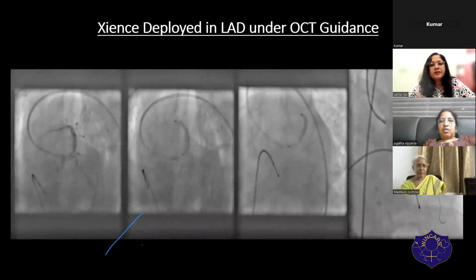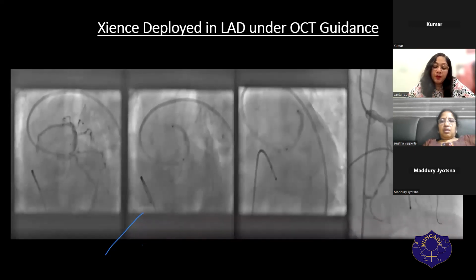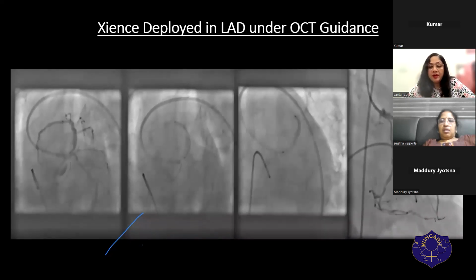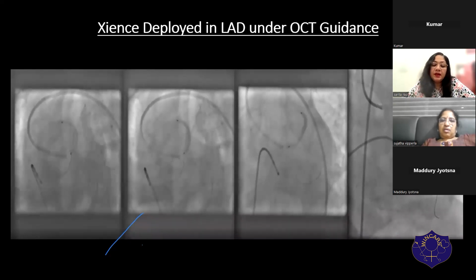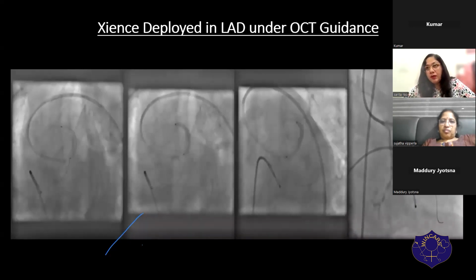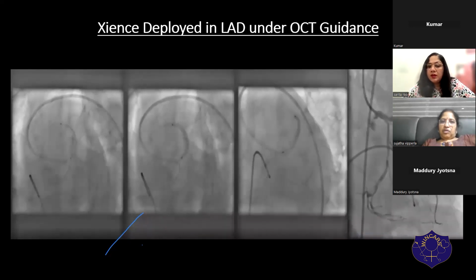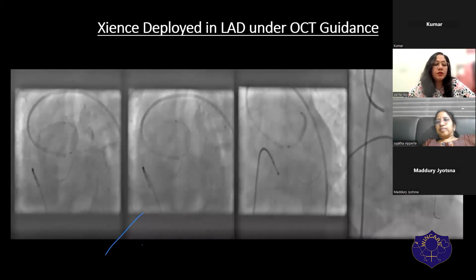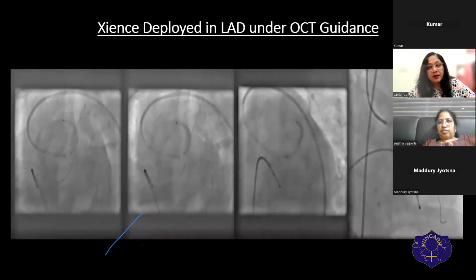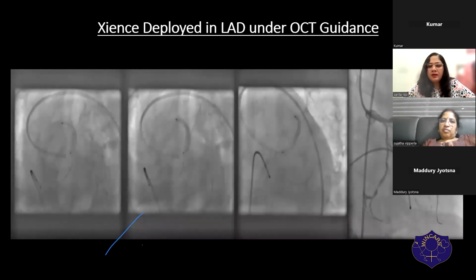Absolutely, madam. That is the most important thing: cutting has to be taken at the proper point in the procedure. When you have already created cracks, when you have prepared the bed, then taking the cutting works very well. It gives you a great dilatation and a great MSA. Had we taken it upfront, it would never have worked, because there are only 3 or 4 atherotomes in cutting balloons, and where they will land is very questionable. But once you have created cracks, fractures, and microfractures, it will work. So that is exactly what we did.